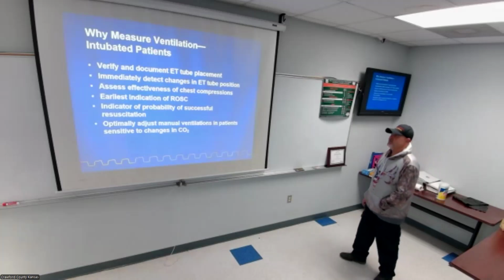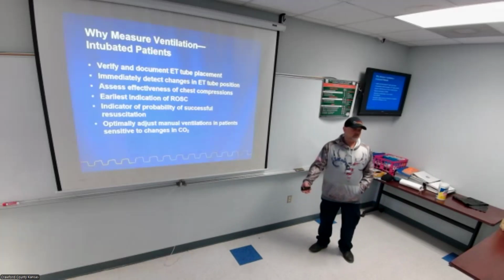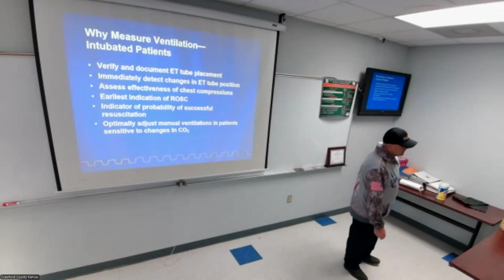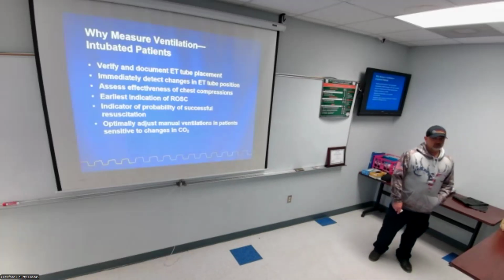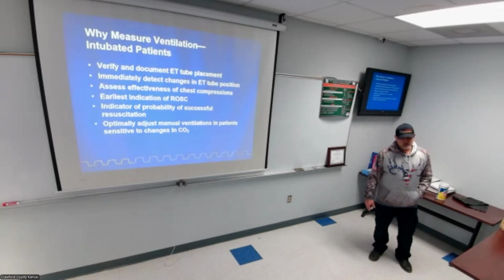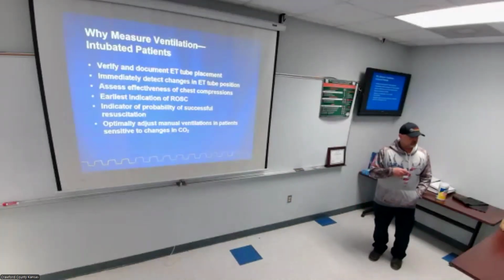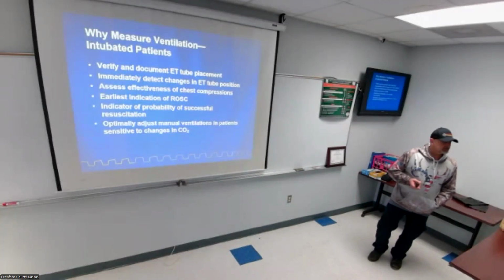Immediately detect changes in ET tube position. I know a lot of us do and leave it on when we change them over to the bed of the ER. I try to, but the simple fact is I can look at that waveform once we move that patient, because, you know, nurses are great out here, but if you're not grabbing the tube to hold it in place, nobody else is going to. They'll just grab that patient and rip them over.